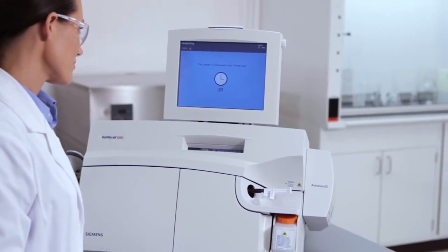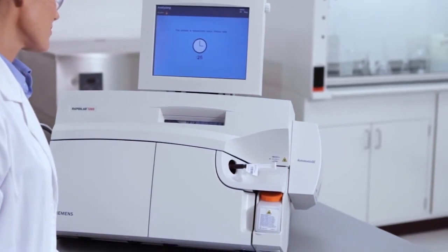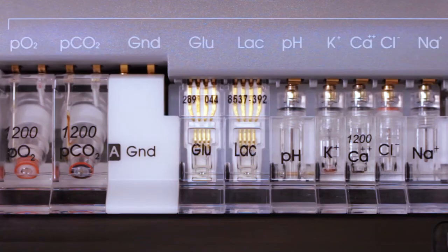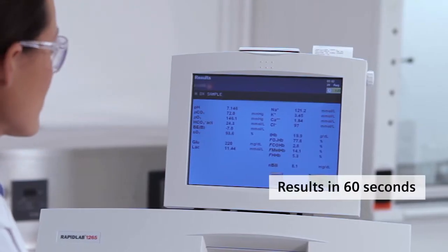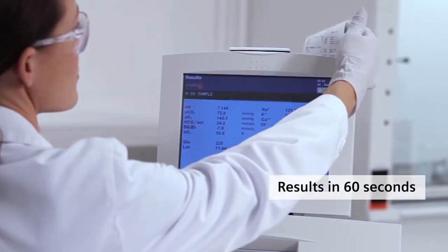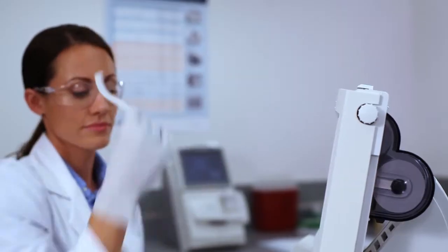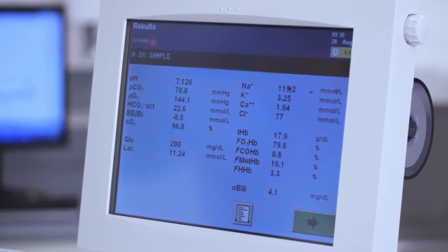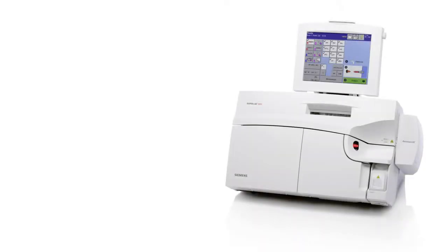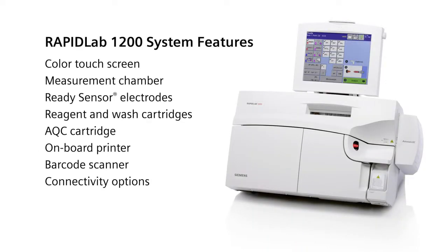Heparinized whole blood is automatically aspirated for analysis. The blood is clearly visible in the measurement chamber so the operator can monitor sample integrity. Results are displayed and printed in 60 seconds and if connected, are automatically sent to the LIS or the Siemens Healthineers point-of-care informatics solution. Let's take a closer look at the RapidLab 1200 blood gas system to better understand its unique features.